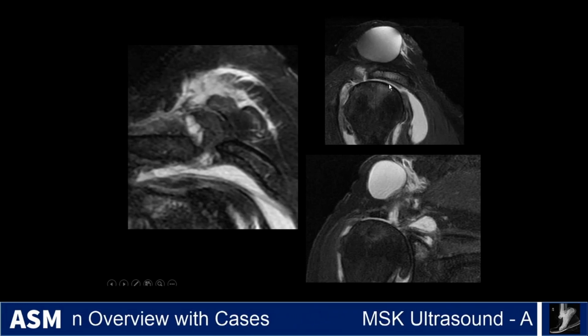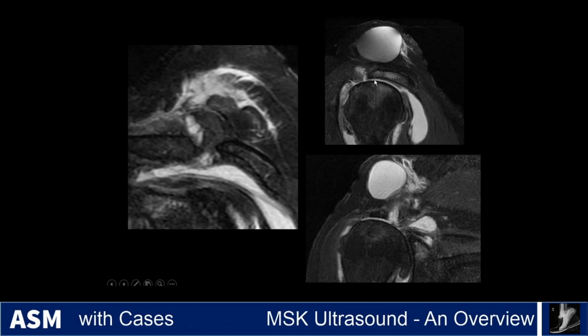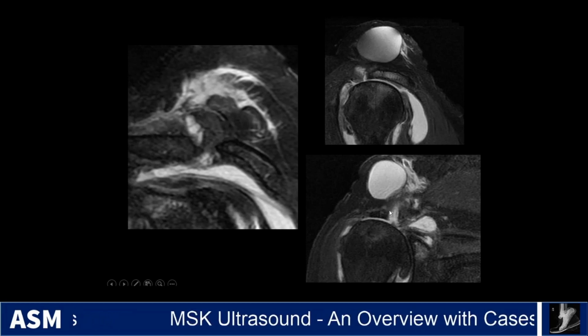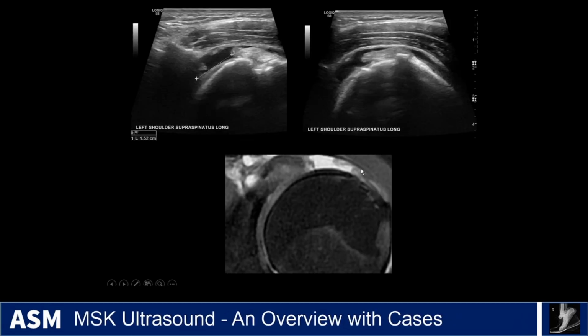this is a joint fluid migration from the injured rotator cuff and AC joint into the soft tissues. So without fixing the anatomic defect, you're going to potentially have more and more joint fluid reaccumulating in these things. So this is a geyser cyst.